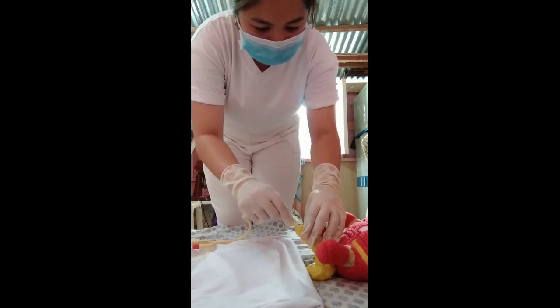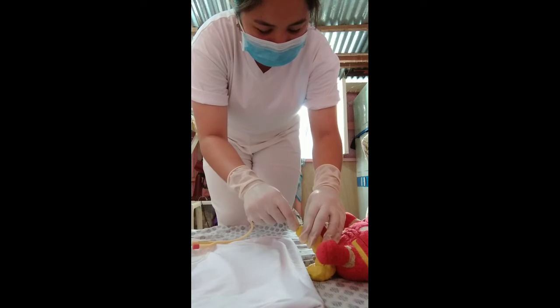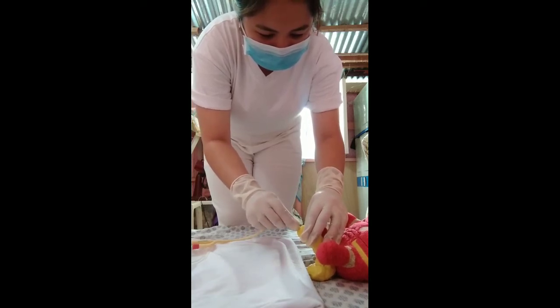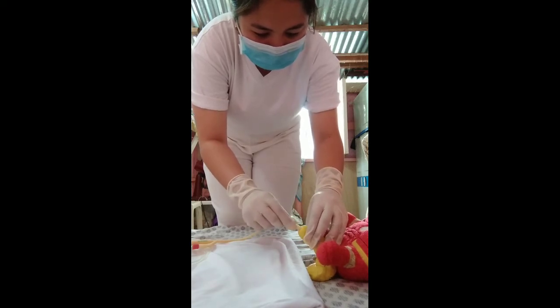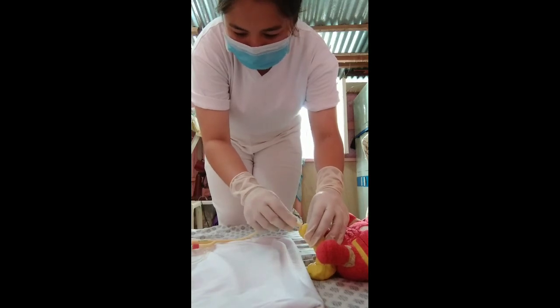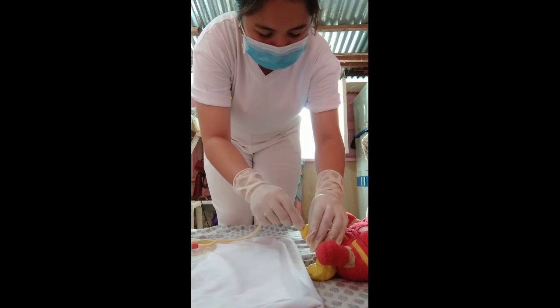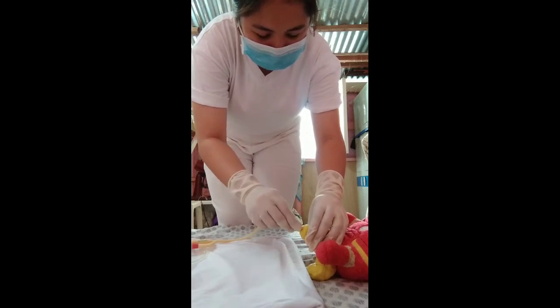I insert the catheter. Inhale. That's good. Good. I see some urine. So we need to advance 2 cm more so that it is in the right place.